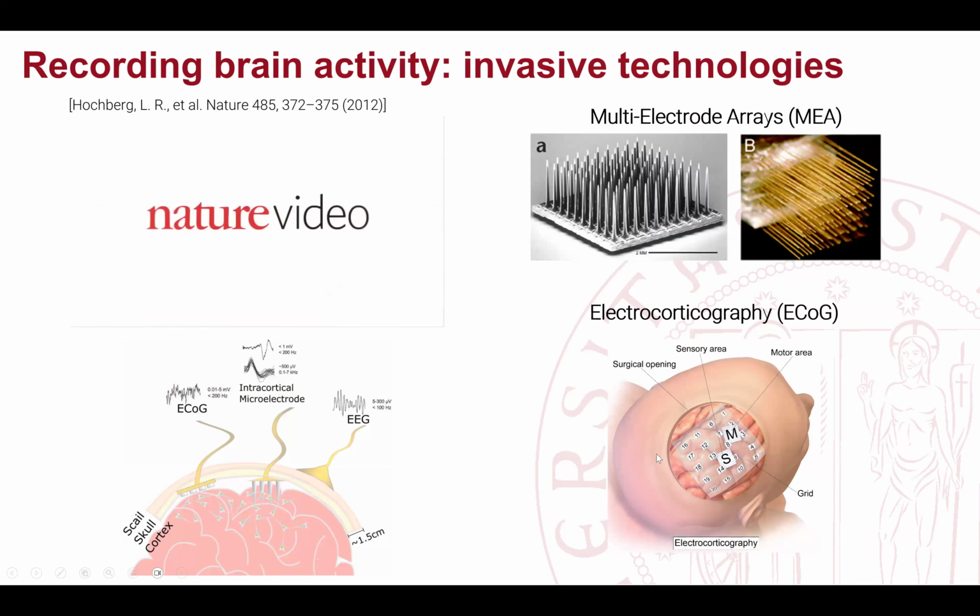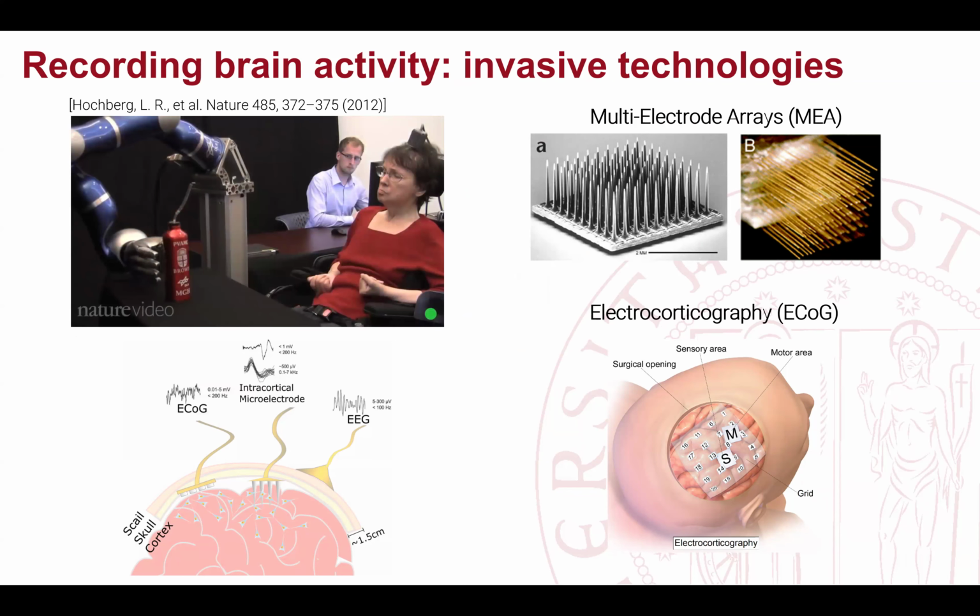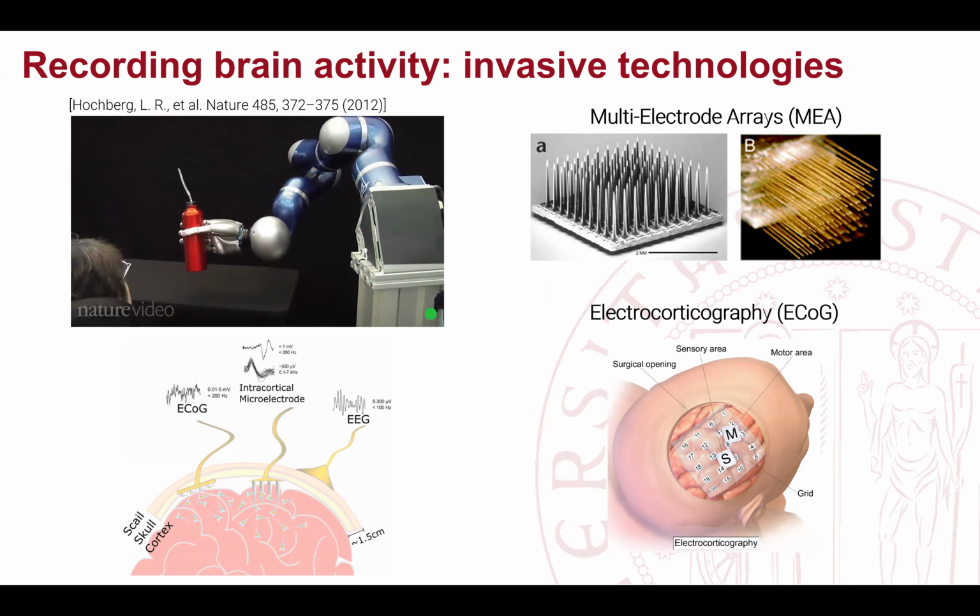Okay, just to let you know that there's not only EEG. There are also other means of recording brain activity. So EEG is not the only one. Maybe you have already seen this video, because it's quite famous and is actually already quite old, from 2012, in which they use an invasive technology for getting the signal directly inside the brain.